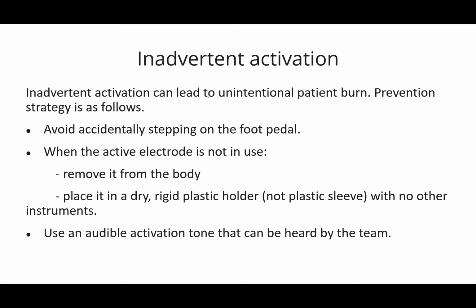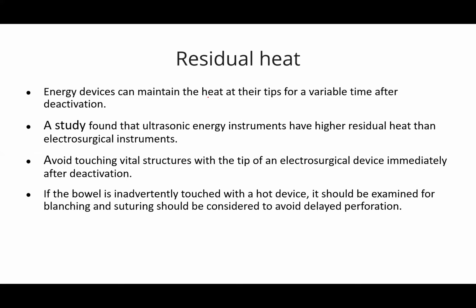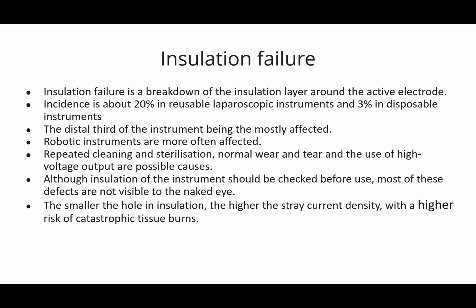So anytime you are using the monopolar or any of the energy instruments, make sure they are not active. Make sure you are not stepping on the pedal or activating the electrode when it is inside the body. Only activate when you are at the desired point of action so that you don't cause inadvertent injury. Now, the residual heat on the tip can touch other structures and cause unintentional damage.